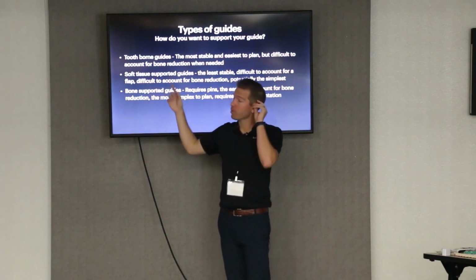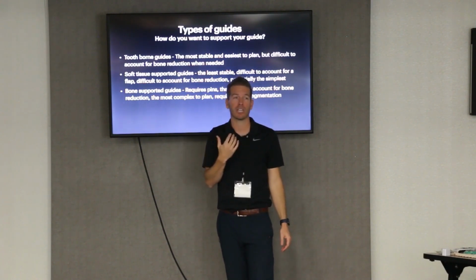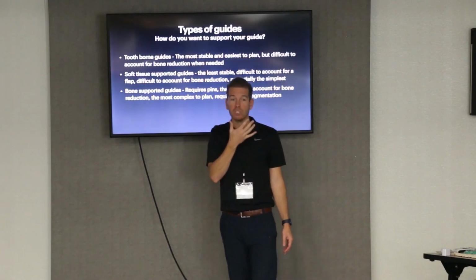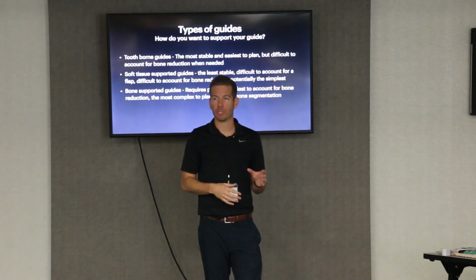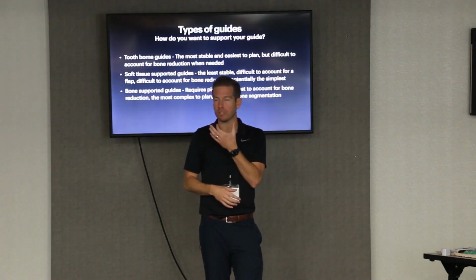A soft tissue supported guide is actually resting on the soft tissue. So an edentulous patient, and it's like a denture, right? You think about a denture sits over the soft tissue and it just rests there. Well, you can build guides like that, right? You could duplicate a denture. You could turn a denture into a surgical guide where it's resting on soft tissue.